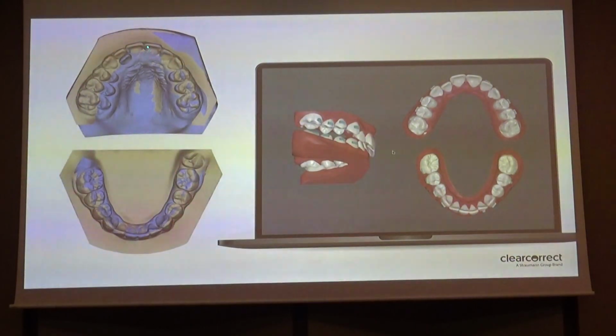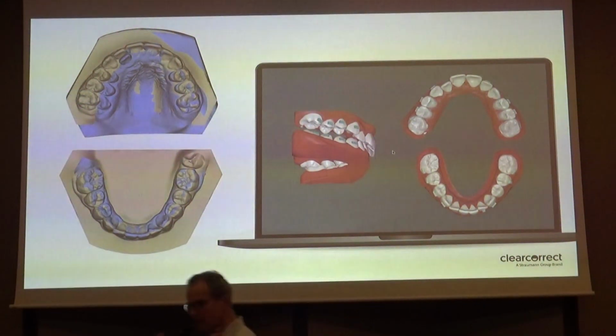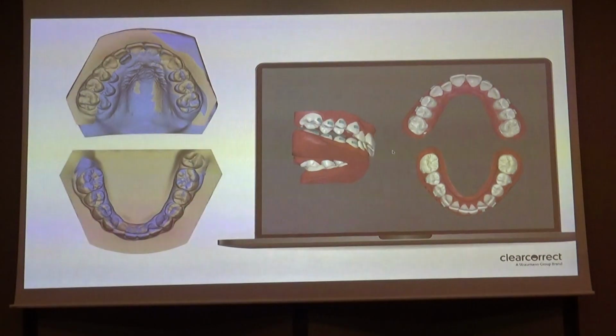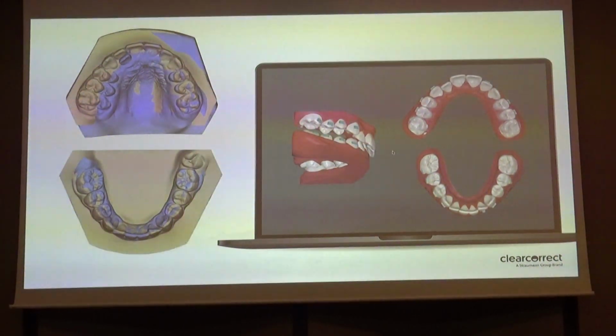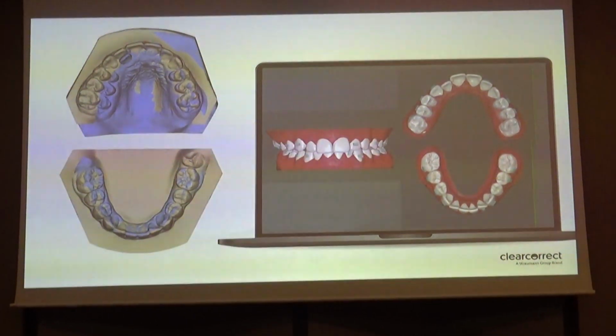Look, after rapid palatal expansion in beige, thì mọi người sẽ quan sát thấy là đây là cái kết quả sau khi mà mình nong nhanh hàm trên. And now we have this situation here. Mình sẽ có cái kết quả như thế này. And now we need to contract the upper and expand the lower. Và bây giờ thì bài toán của mình đó là mình sẽ phải kéo thu hẹp hàm trên và nong hàm dưới. And that's our plan. Rồi đó là cái kế hoạch của chúng ta.